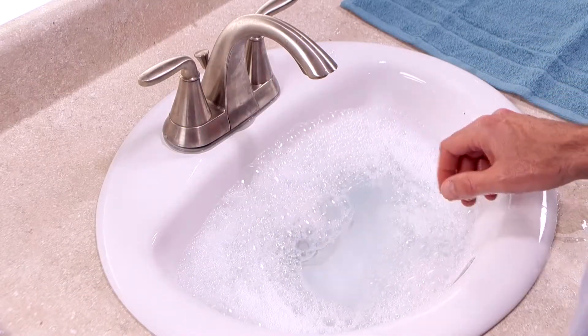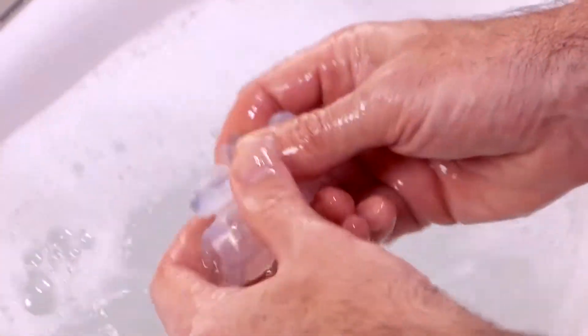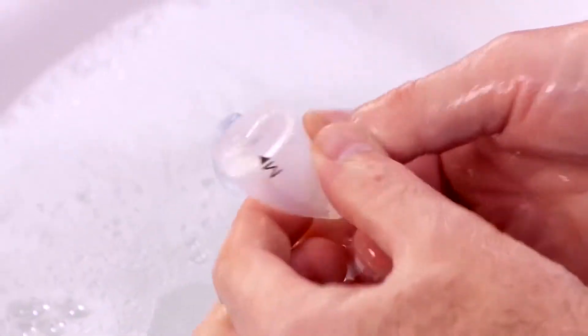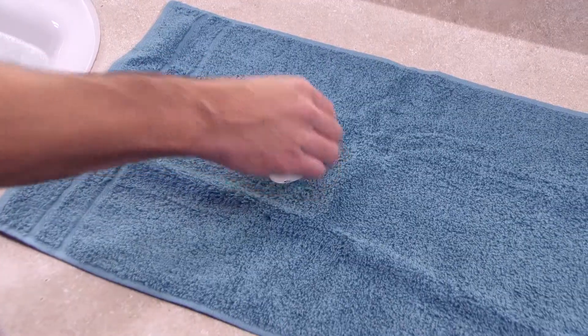Hand wash the non-fabric parts — the mask cushion, mask frame, elbow, and tubing quick release — daily in warm water with mild liquid dishwashing detergent. Submerge the parts and examine them to make sure there are no air pockets present. Rinse the clean parts thoroughly with water, then let them air dry completely before use.